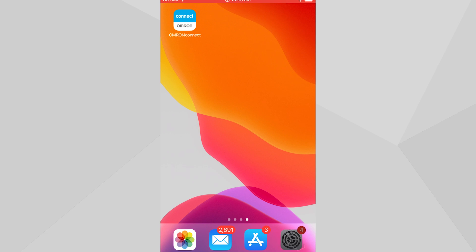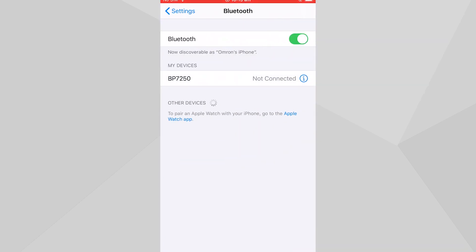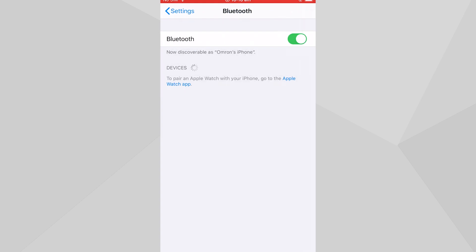Open Settings on your smart device and open Bluetooth by tapping on it. Search your My Devices list for a device that starts with BP, HEM, BCM, or BLE Smart. Tap on the eye icon to the right-hand side of the device, then tap on Forget This Device and confirm by tapping on Forget Device to remove it from your device listing.